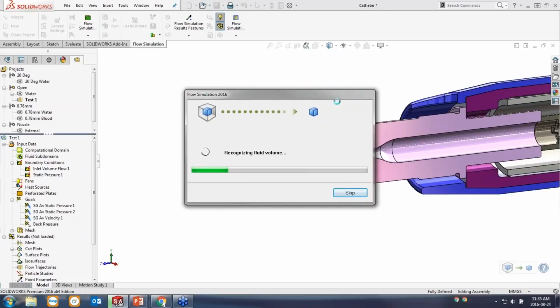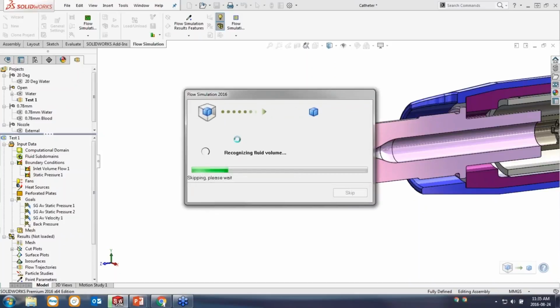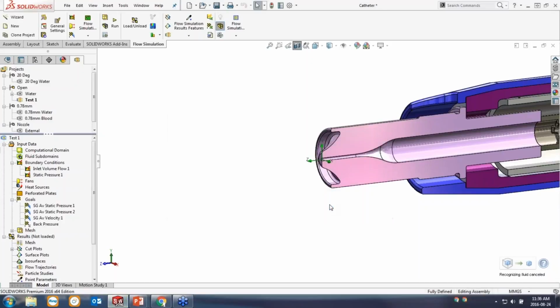Now, I've actually already gone and done this, and I've taken it a step further, so I'm just going to kill this in the process right here. And we'll go through and talk about something called a parametric study, which is basically this process of going back to SOLIDWORKS, changing the geometry, and then running a new analysis, but automated.